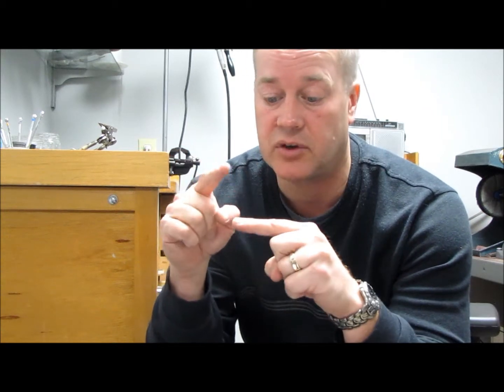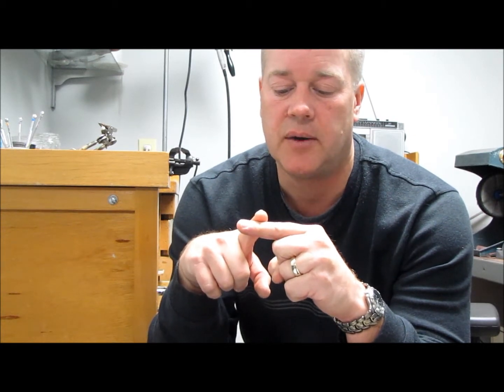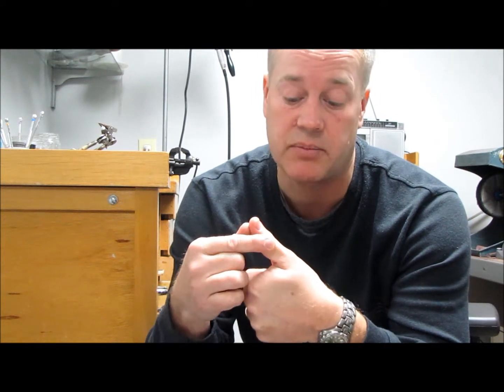Now I work with the fingers, like I had said. I work with any of the IP joints, plus the MCP of the thumb. An IP joint is an interphalangeal joint. It involves the proximal interphalangeal joint, or the PIP. There's the DIP, the distal interphalangeal joint. I work with the IP of the thumb. We can also stop it from hyperextending, as well as the MCP, and I'll show you the MCP splint in a little bit.